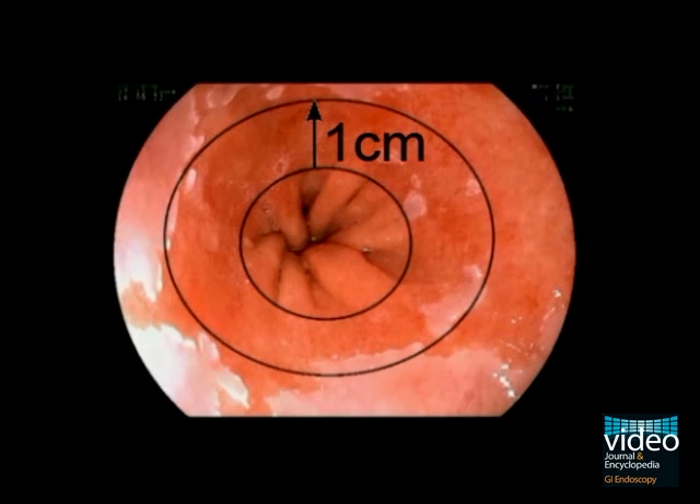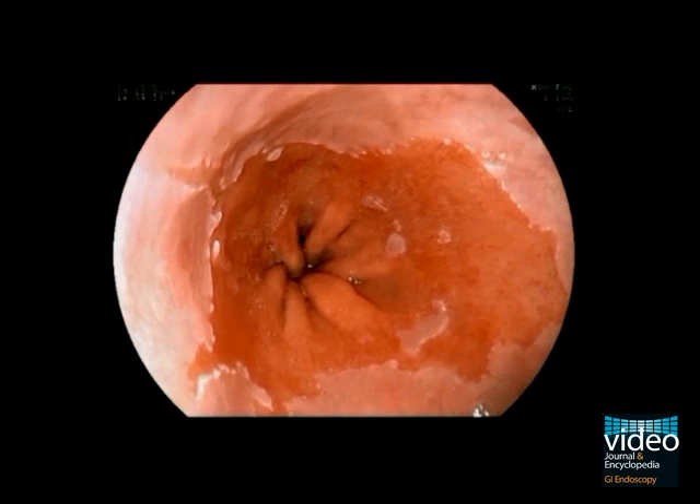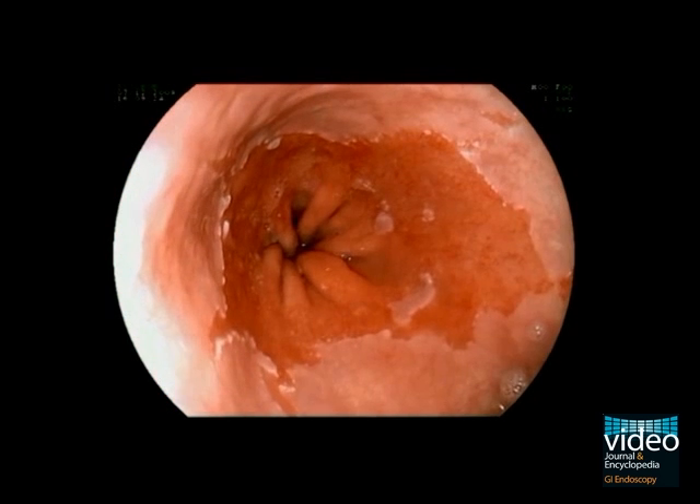According to the Prague classification, this distance in centimeters constitutes the C-value that denotes the circumferential length. Islands of squamous epithelium are not considered in the classification system.